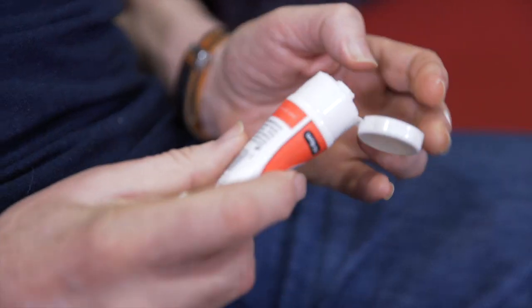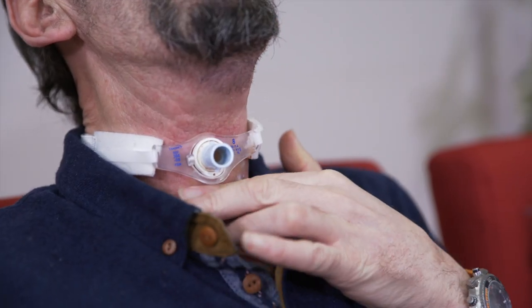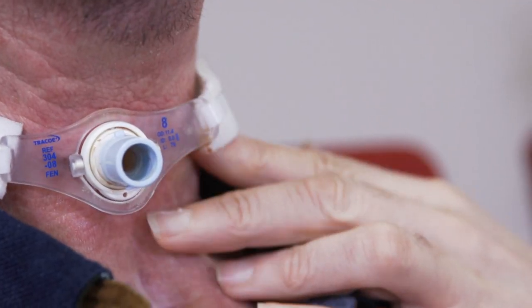Barrier cream can be applied to the surrounding skin, round about the stoma, under the flange and under the neck tapes.